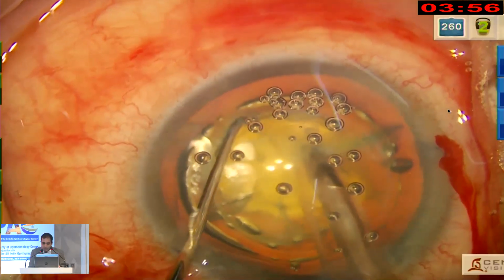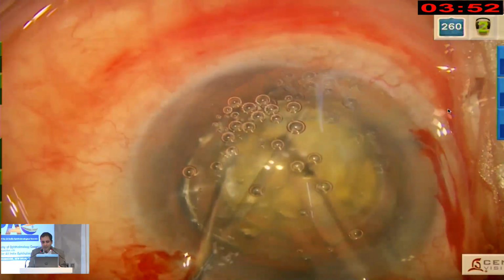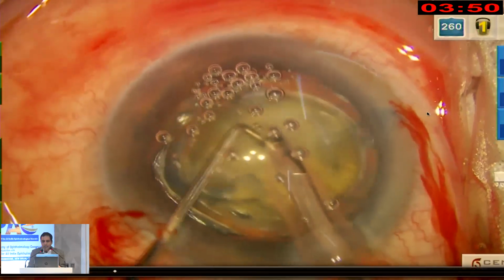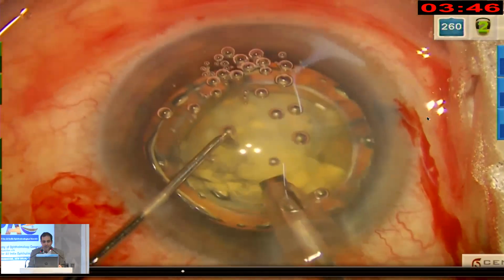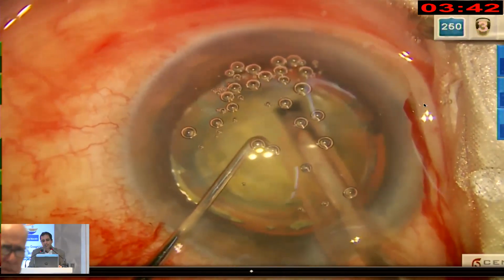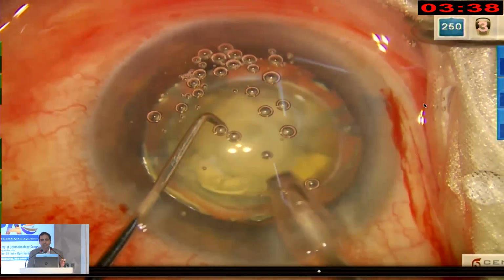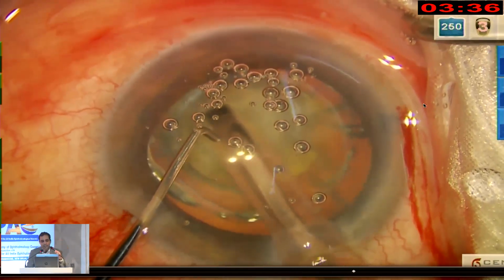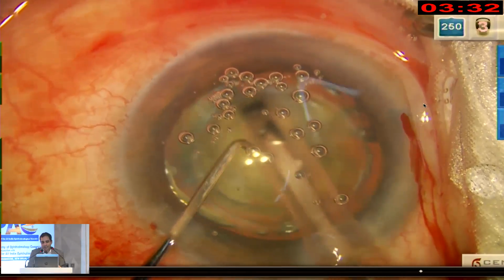We like to do the cylindrical lens division pattern, and quite often in these dense cataracts, like Dr. Titial sir correctly showed in his publication, you may need to separate the endonucleus because it's a very, very dense cataract. So it's unlike a soft posterior polar of a very young person. This is not going to flip out just by rotating or just by aspiration. So here I'm struggling, to be honest. I couldn't create a decent enough crack.